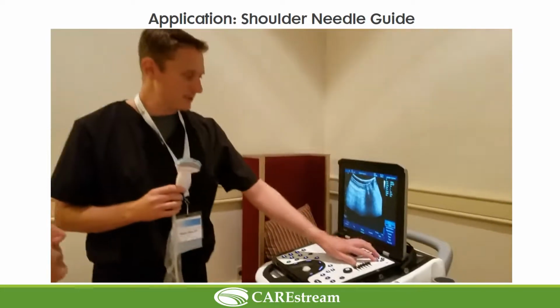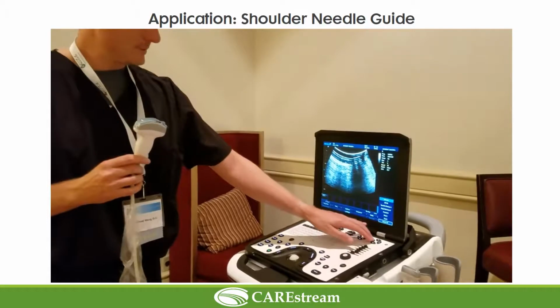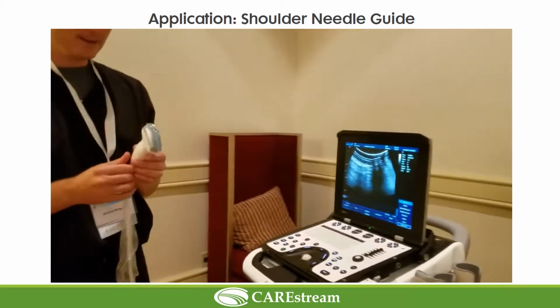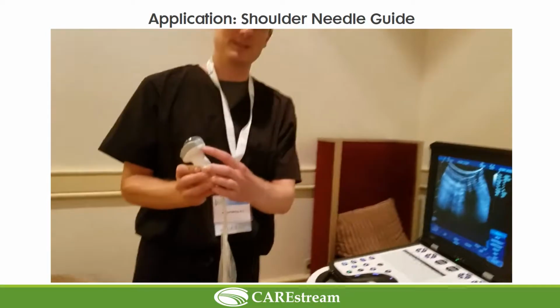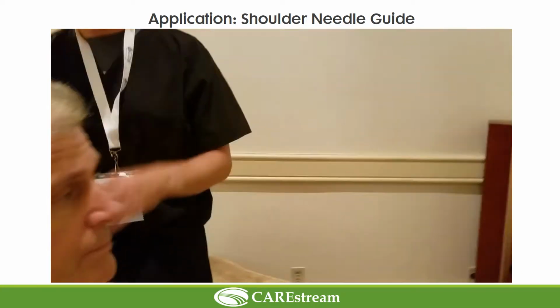So again, I'm going to adjust the acoustic power one more time. So we'll take the acoustic power down to about 45. So for this injection, again, I'm going to put the notch towards the midline. So, the notch to the midline. Come over here for just a second.